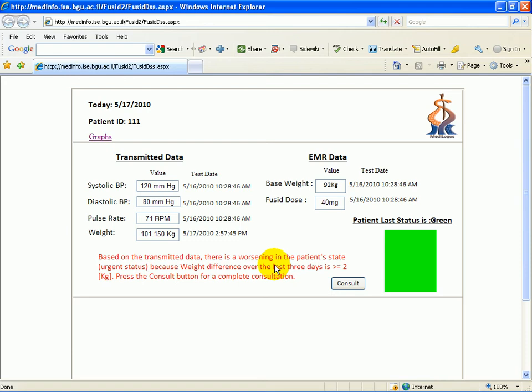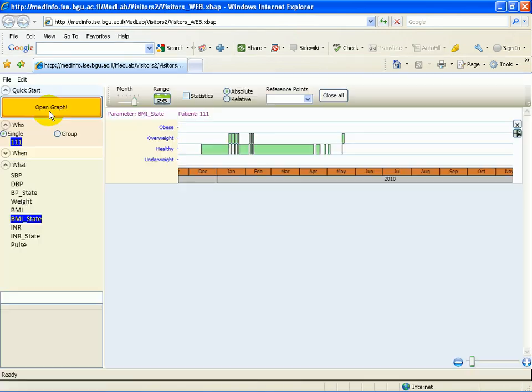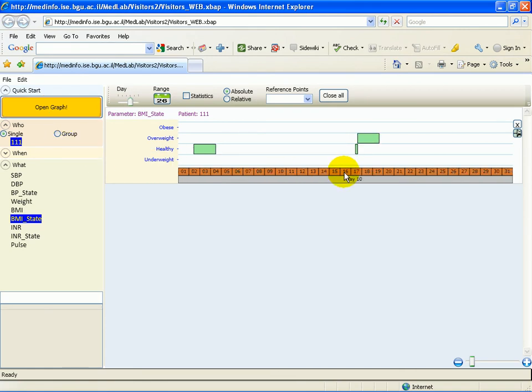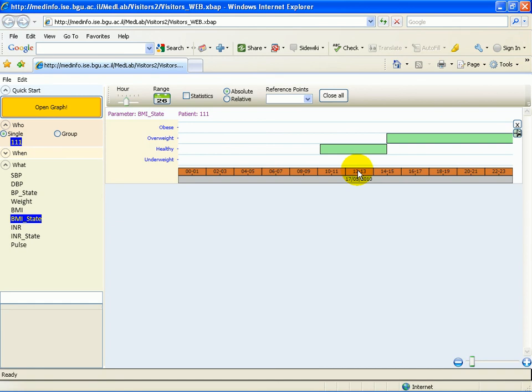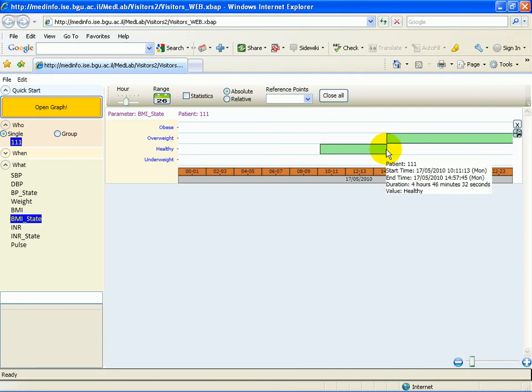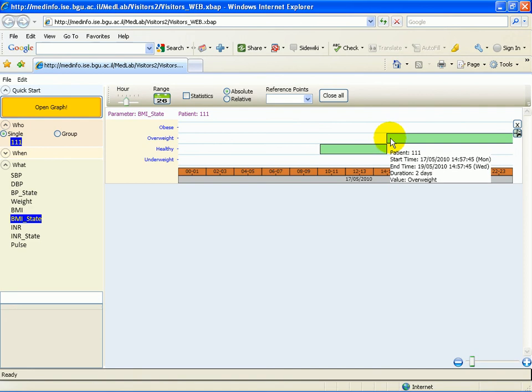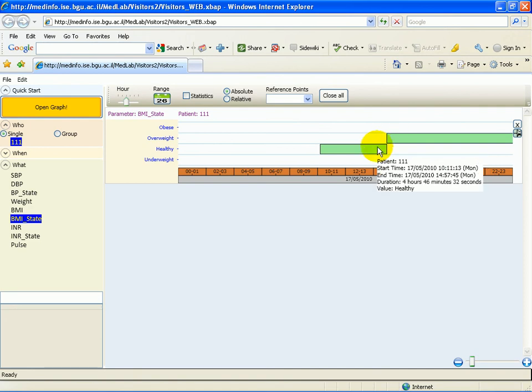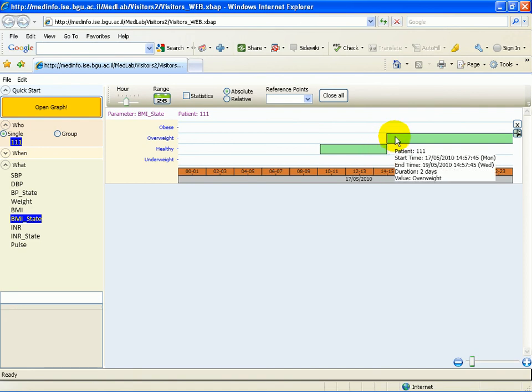We will now show you how this is shown inside the graphical system. As we can see by clicking on the relevant data, the information that has just been received clearly shows to the clinician that the state of the patient has been changed. The BMI state has moved the patient from the healthy state to the overweight state based on his new data. This will of course affect the guideline as we will now show you.